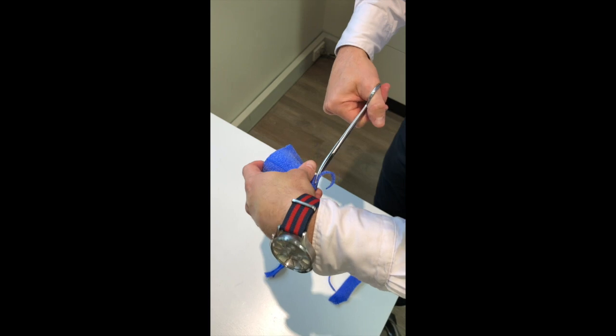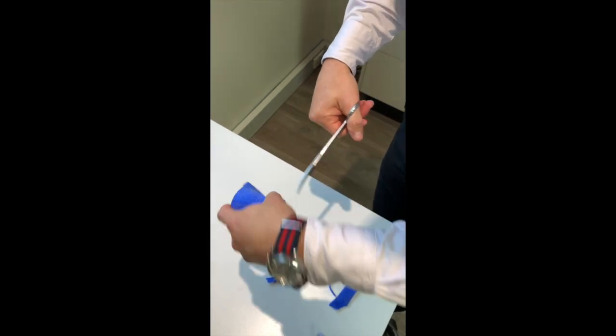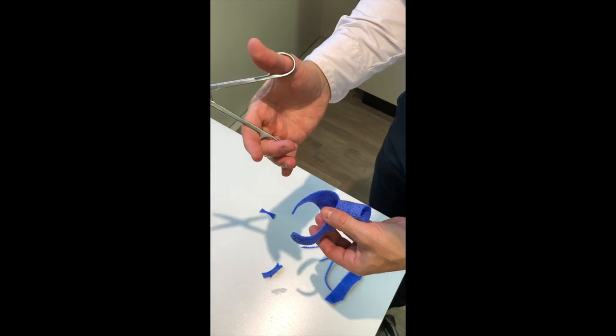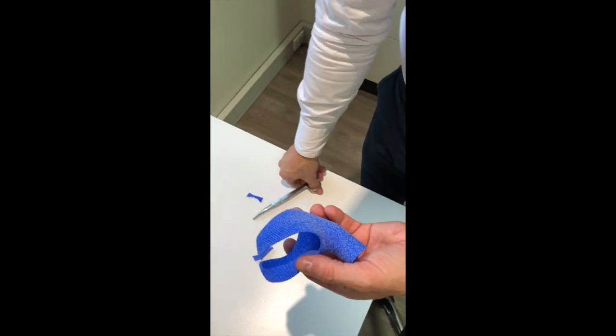You can see how easily I'm cutting this product, which actually is quite rigid — cutting it with a very simple pair of curved scissors. It's quite a user-friendly product.